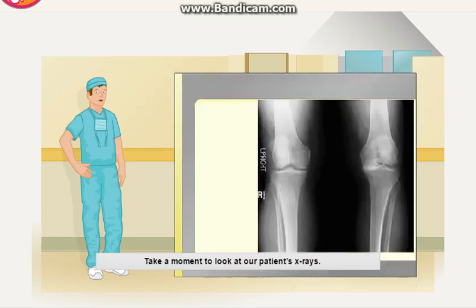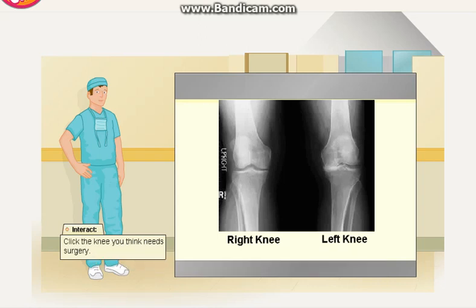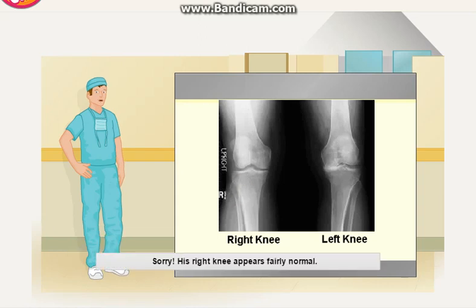Take a moment to look at our patient's x-rays. Which knee do you think needs surgery? Sorry, his right knee appears fairly normal. His left knee appears worn down and lacking cartilage, which is likely the cause of his pain.